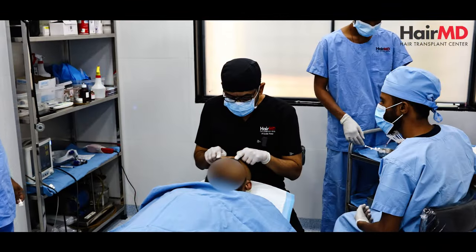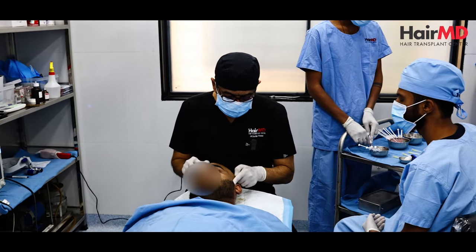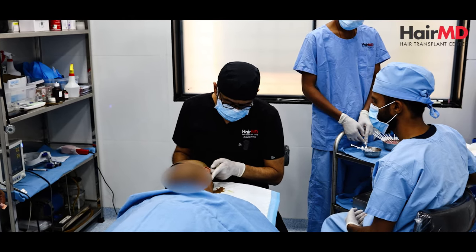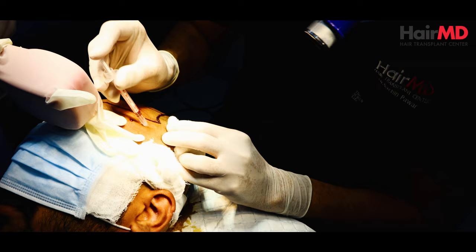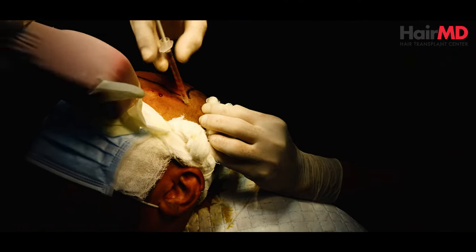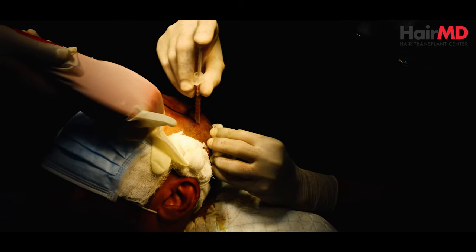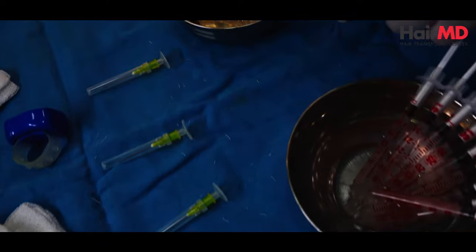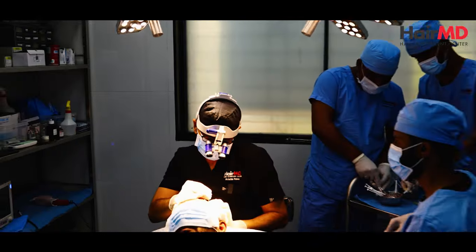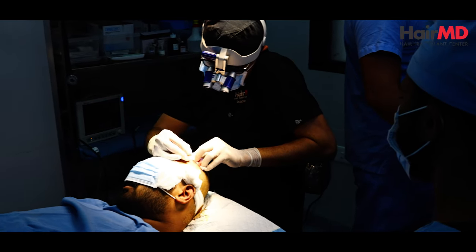The nerve block covers the supraorbital nerve and supratrochlear nerve. We then administer anesthesia around the full perimeter of the patient's head, including the back and sides, to ensure the entire operative area is numb before proceeding.